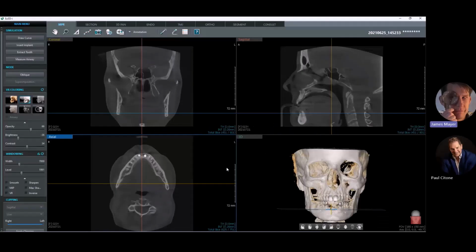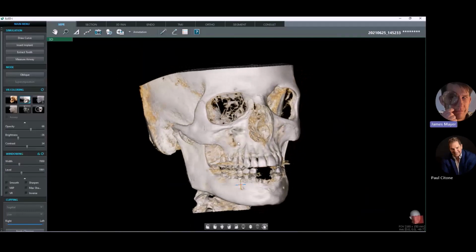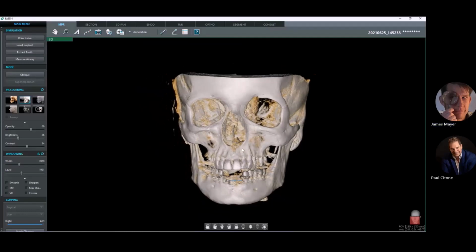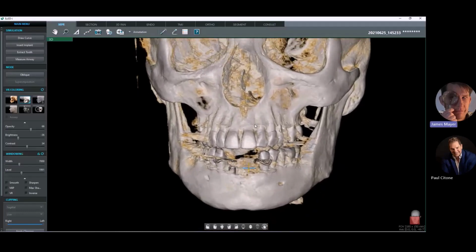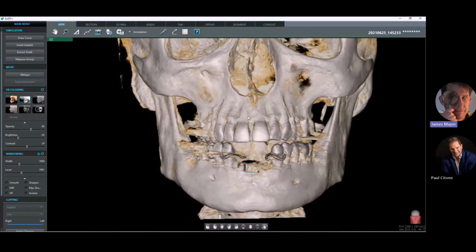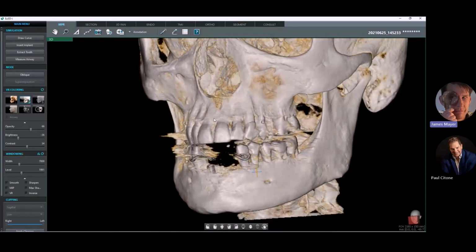So Paul, we just finished up looking at patient movement. Now let's look at a little bit of distortion or artifact you see in scans that's highlighted as scatter in the images. So I'm going to go ahead and enlarge our 3D rendering here. And we can see off of any dense areas, you can see a little bit of scatter or streaking effect in the image. And there is our compressed sensing technology to reduce that, but you're going to get a little bit of scatter in the data sets, and that is the nature of cone beam right now.